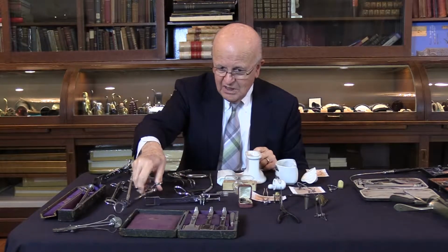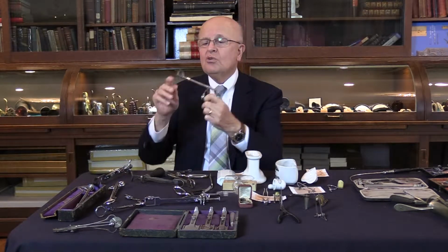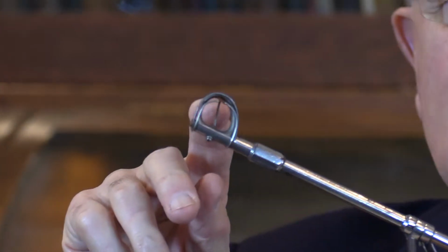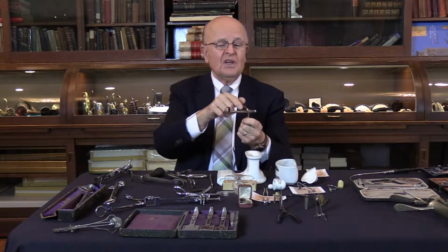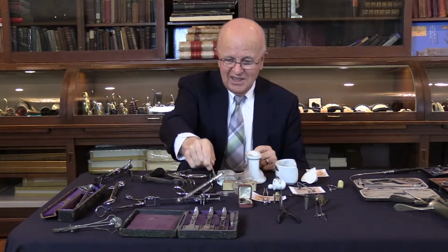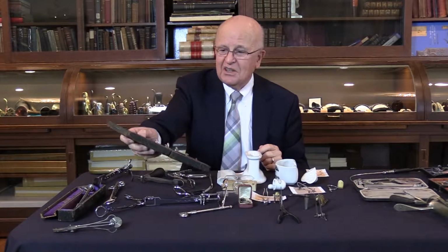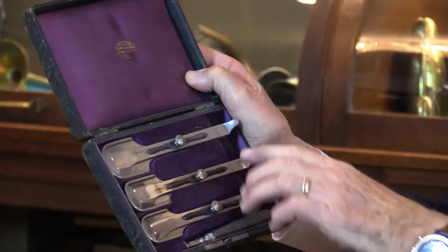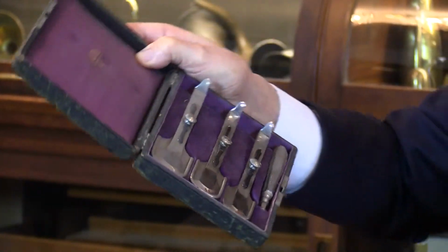They even had another way of doing it, which is this hook here. This was used if there was any piece of tonsil left behind; they use this to remove it, and this hook will hold it in place rather than the patient swallowing it. And these came in different sizes, and this is a very interesting piece. I have never seen one like it before, which has different sizes depending on the size of the tonsil.